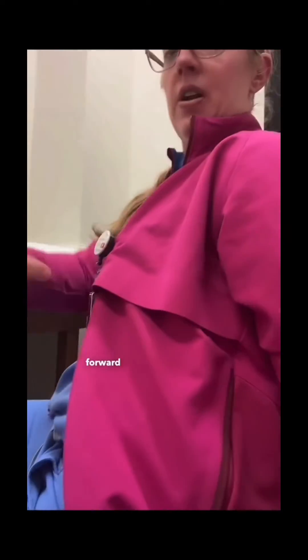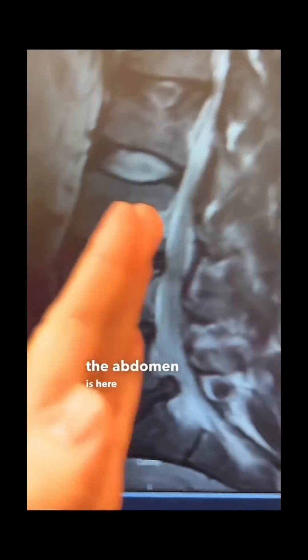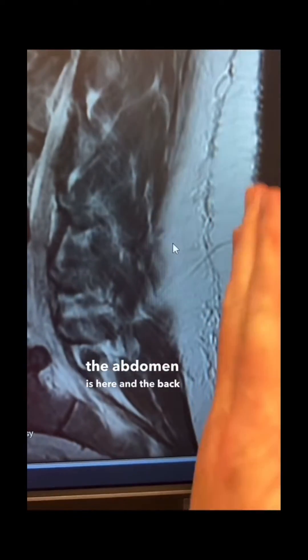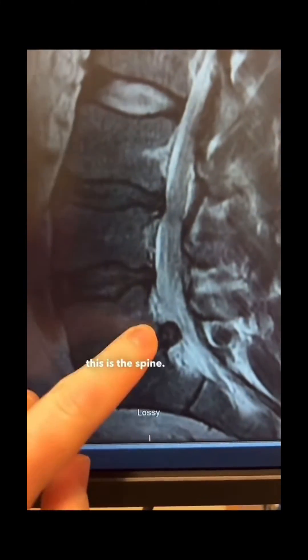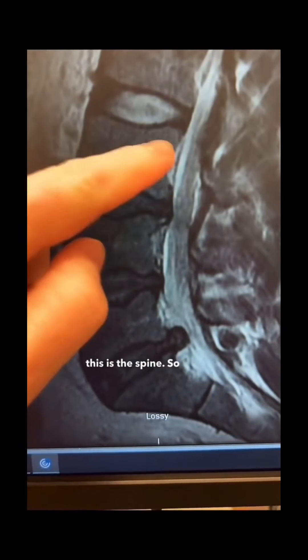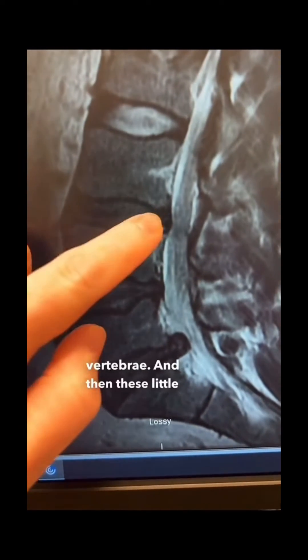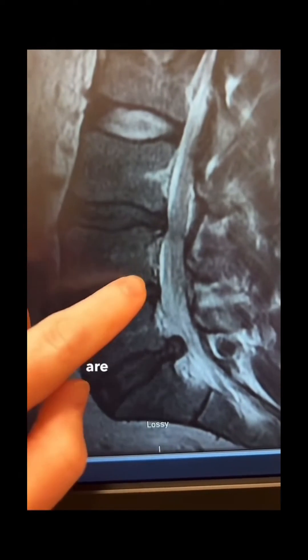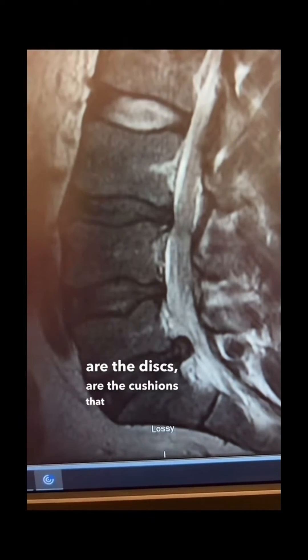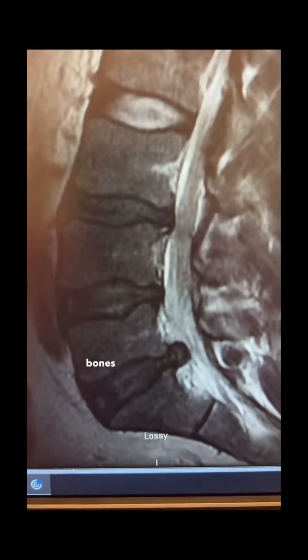So if you were facing forward and we were looking at your back from the side, those are the pictures that we're seeing. In this MRI, the abdomen is here and the back is here, and this is the spine. You see that the squares are vertebrae, and then these little spaces here are the discs, or the cushions that sit between the bones in our back.